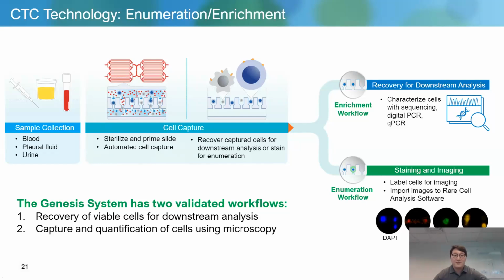It is very powerful, given that people in the CTC field spend significant time to stain and visualize captured cells to figure out what those cells really are. So we are going to cover these 2 system protocol options for 2 workflows, such as EGFR mutation detection in CTCs, and the dual CTC ctDNA isolation workflow, which we are going to talk about in a later chapter.